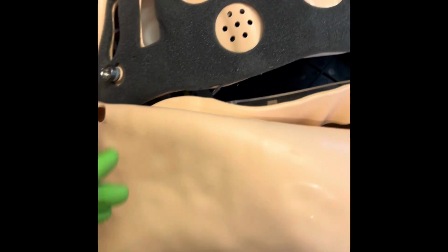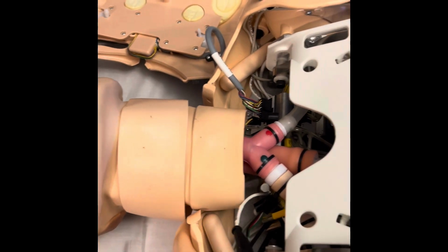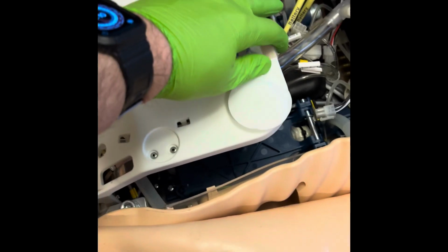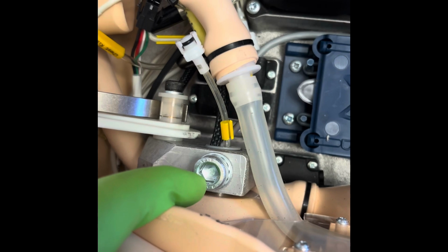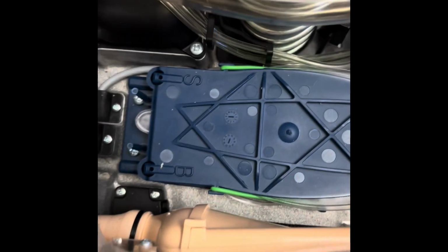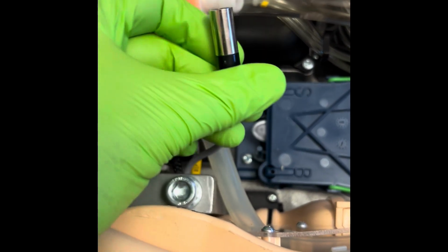First thing we're going to do is unzip the skin on the upper left and lower left. If you have the newer chest skin, it could be on the right side as well. Take the chest plate and then unclip the defib cable and just roll the chest plate assembly off to the left here. Take the abdominal assembly, sorry, I can't talk today, and raise up the chest spring assembly. In here, you're going to see the Allen bolt there, and then there'll be 3 connections, which mine are already unhooked. But there's the wire connection, 1 hose connection, and then another wire that's gray with a silver tip. So this gets released, kind of spin it around, on the other end with a button there.